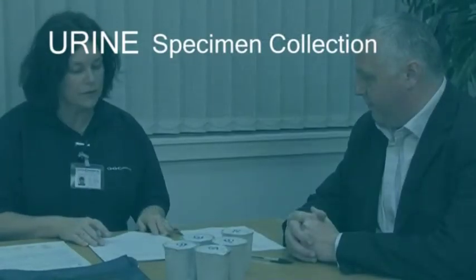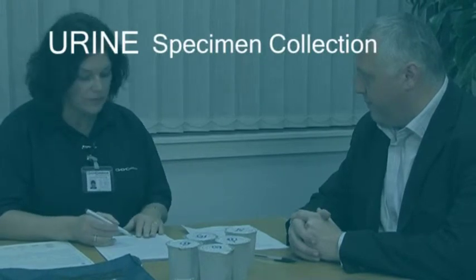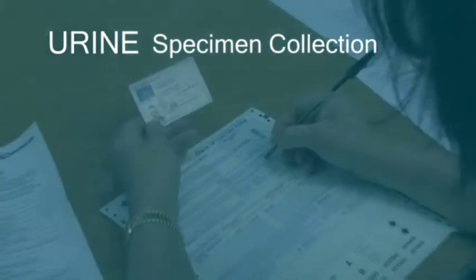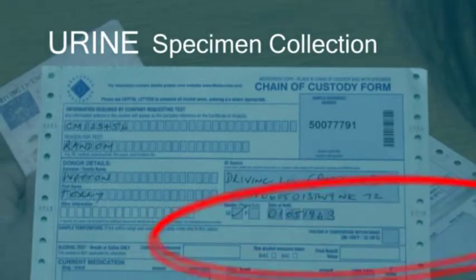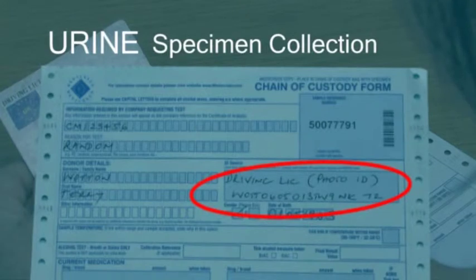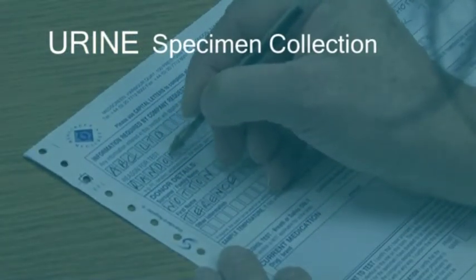You then verify the donor's identity, asking the donor to reconfirm their date of birth and checking details like the spelling of their name. These details should be completed on the chain of custody form. Note the source of the identification, giving the number of the document but not bank card numbers. Please use clear lettering when completing the form.